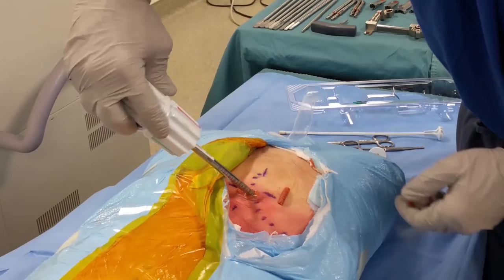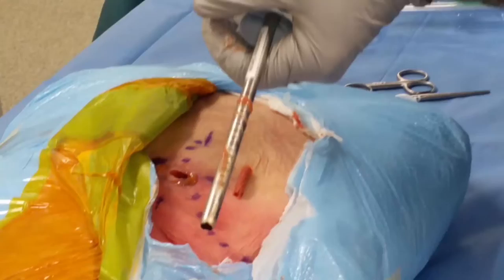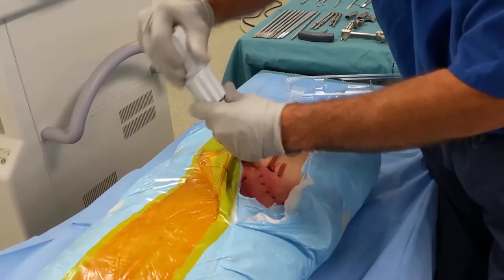Now we're going to go back into the same hole. And I'm going to lock it again. I'm going to open it again, put my tamp in, and I'm going to deliver some more bone.